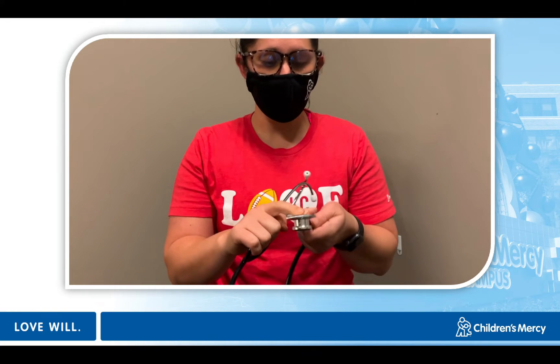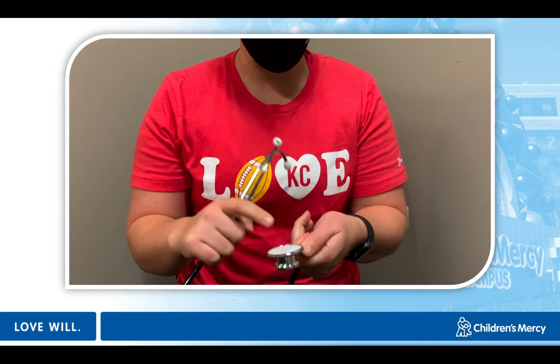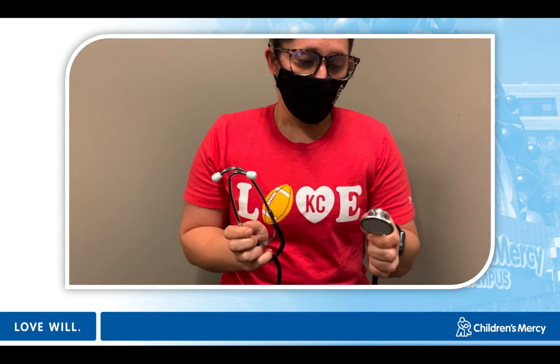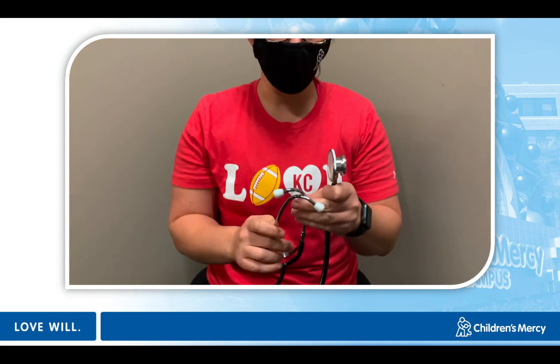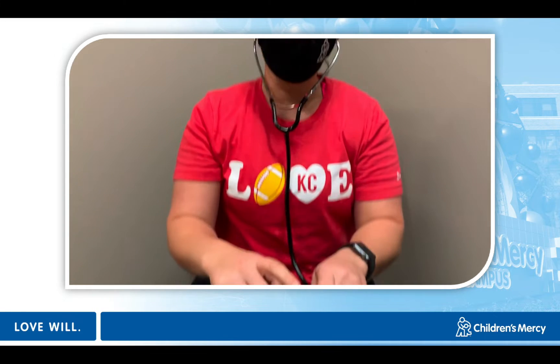There are two sides to your stethoscope: the bell, which is the smaller side, and the diaphragm, which is the bigger side. The diaphragm is the side you're going to want to put on your child's heart. It does turn, so it's possible you won't be able to hear if it's on the wrong side. I always recommend before you put it on your child, put the ear pieces in towards your nose, then tap on it. If it's not loud enough, turn it and tap again. Play with it and figure out which side is loudest, and then you're good to go.